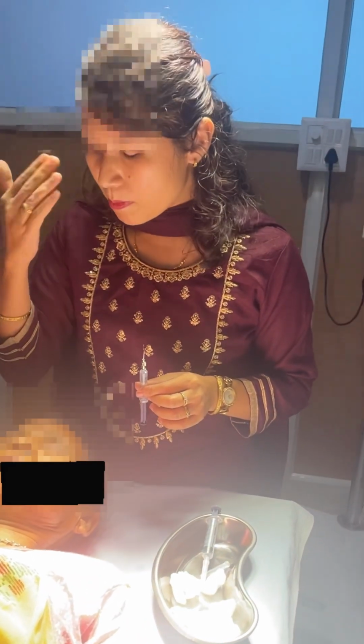Before we proceed with the procedure, we have given the topical anesthetic drug. Now we will ask the patient to look at my forehead. You need to explain to the patient that we will do the procedure, and there will be fluid coming into your mouth. Why will the fluid come to the mouth? Because the nasolacrimal duct opens in the nose. In which meatus? Inferior or middle meatus? Middle meatus? Which meatus? Why are you confused now? Inferior meatus.